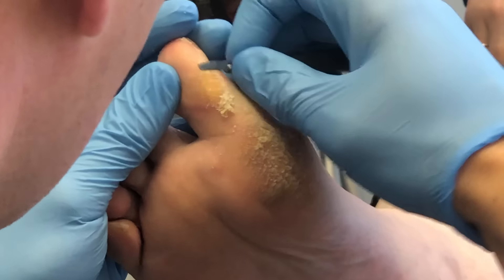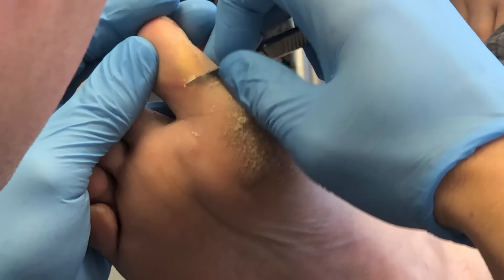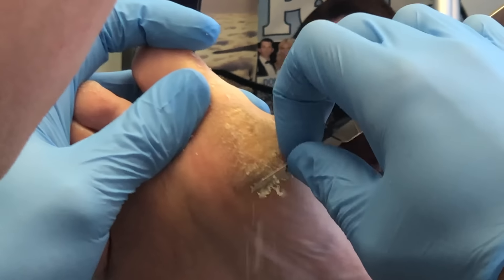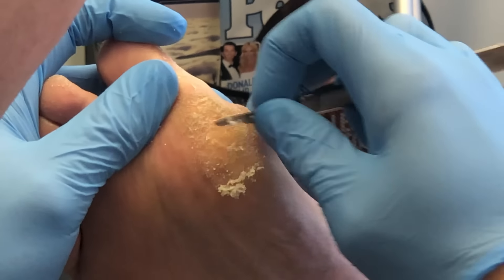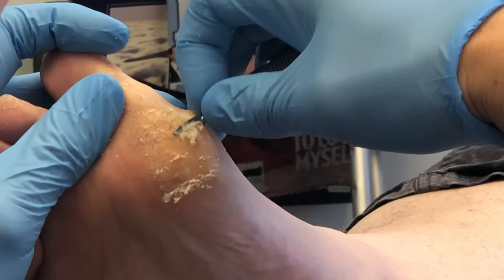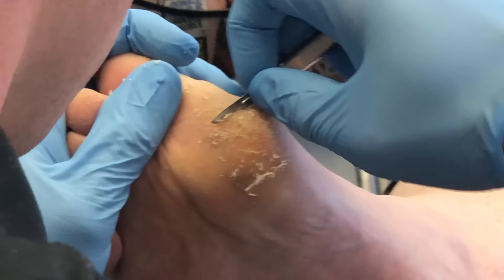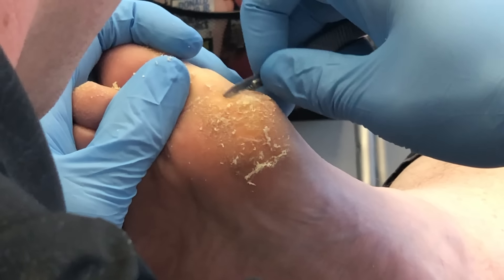We're working on the other side of the foot on the toe. You'll notice that at the big joint there is some dry skin — it's a high-pressure area for this patient. This is common in that area, especially with the bunion. You'll notice they're not going to get adequate dorsiflexion of that first MPJ joint, so they're going to have buildup of callus because of toe-off through this location.